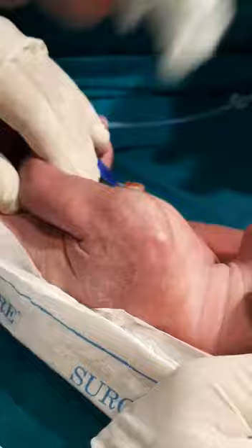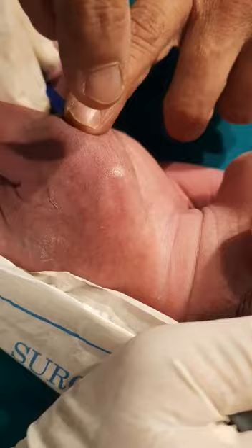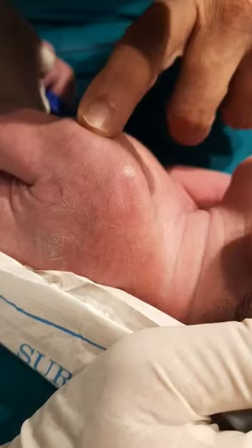You can simply wipe it and see that the wheal is there. Note the size of the wheal at the time of vaccination. At six months, you must look for the scar — the size of the wheal will correspond roughly to the size of the scar you're going to get. A wheal produced like this will ensure that the BCG will be taken up. Thank you so much.